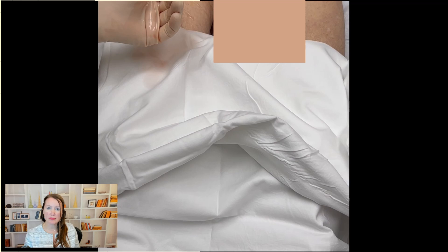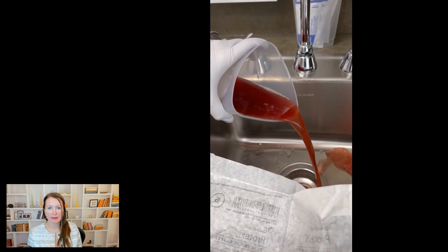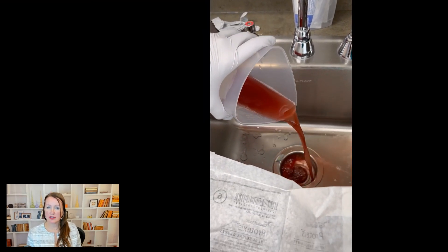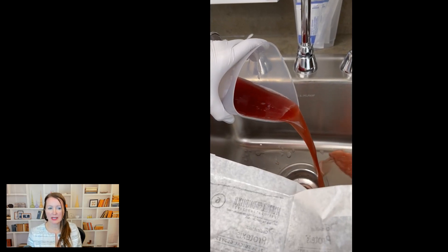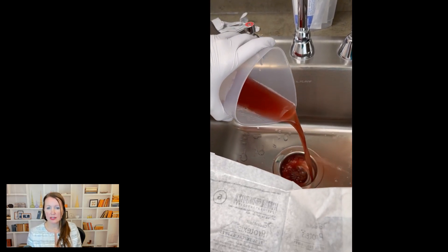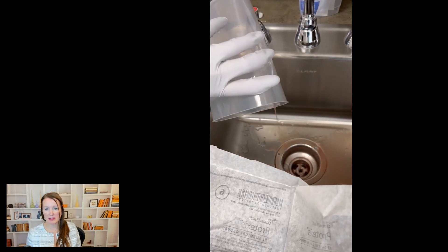It's important to keep the bladder full enough that you can remove a syringe without hitting the bladder wall. Eventually, you get relatively transparent urine with no clots. Depending on how clear the urine is, you can perform hand irrigation as needed or start your patient on continuous bladder irrigation.